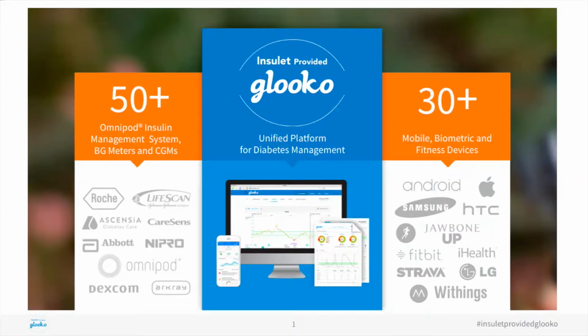Glooko is provided to OmniPod system users and clinics by the name Insulet-provided Glooko. Insulet-provided Glooko overlays data for the OmniPod system, more than 50 blood glucose meters, Dexcom CGM, and more than 30 biometric and fitness devices, and puts this data together into a unified, actionable platform. The system also provides the capability for OmniPod system users to remotely upload their diabetes devices outside of the clinic by Android mobile devices and Mac or PC computers.